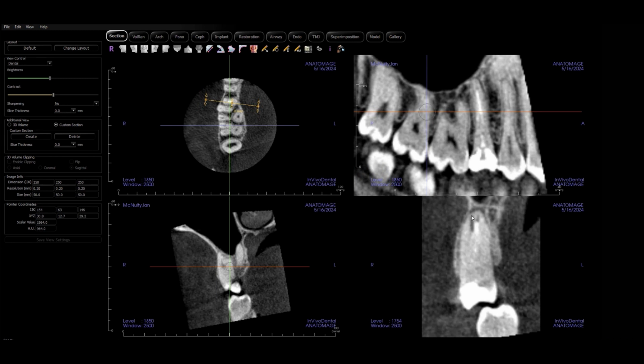You then pull, you don't have to pull out that first one, which is a gutta-percha point. You then use the warm vertical obturation to burn out down to about here, which will heat up some of the gutta-percha and further fill in this isthmus zone that hopefully was completely filled with the gutta-percha from the GuttaCore carrier-based obturation method from that first canal. But you would then burn down, doing your warm vertical, compress this area the best you can, and then backfill with the GuttaSmart warm vertical technique using hot gutta-percha or warm gutta-percha.